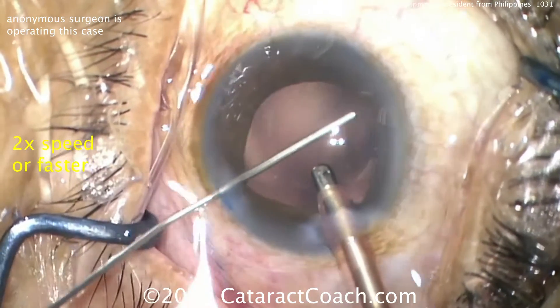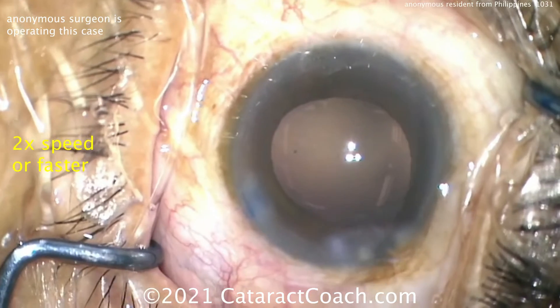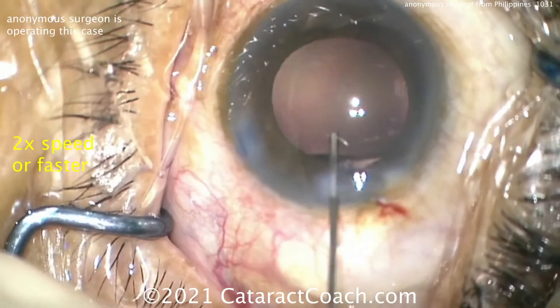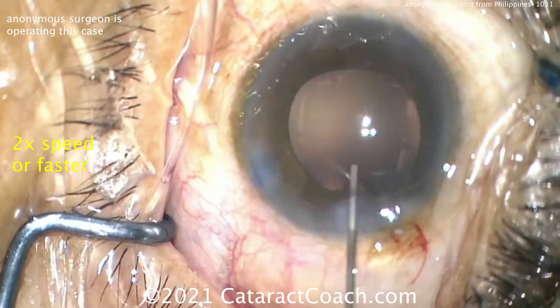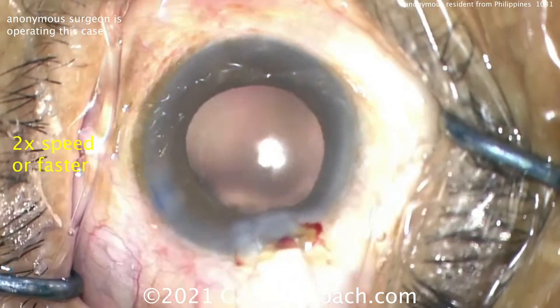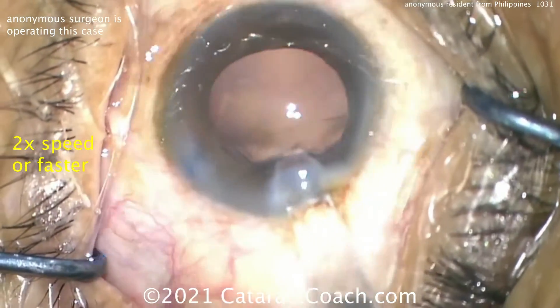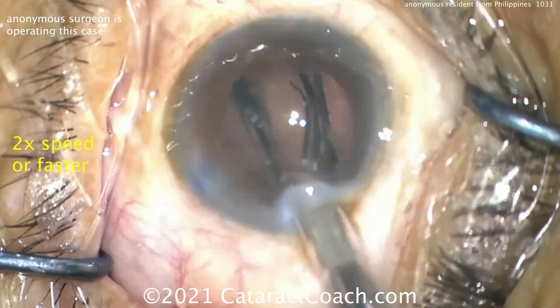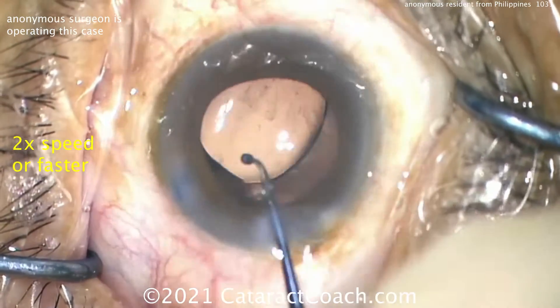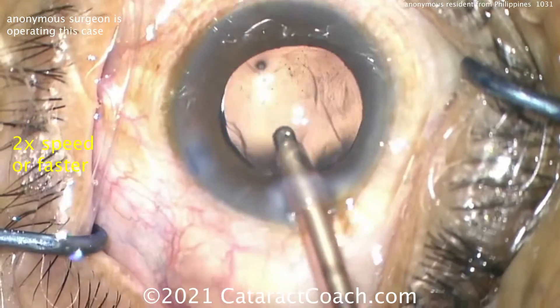Putting in viscoelastic and not letting the eye deflate — I like that, it's preventing the eye from collapsing. Good fill of viscoelastic before implanting the lens. Push that iris back in — the iris is popping up because of too much viscoelastic behind the eye, creating a pressure gradient. Here comes the lens — you've got to fixate the eye with your other hand. Keep it in primary; don't shove the eye toward the nasal canthus — that's not elegant and gives a lot less control. But the lens comes out fine and is in the capsular bag.